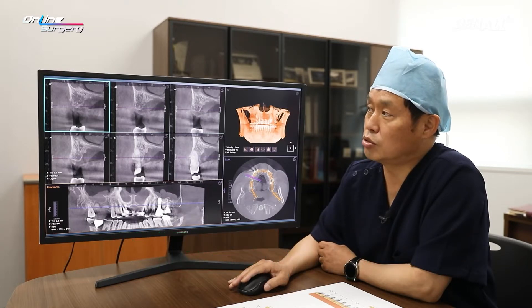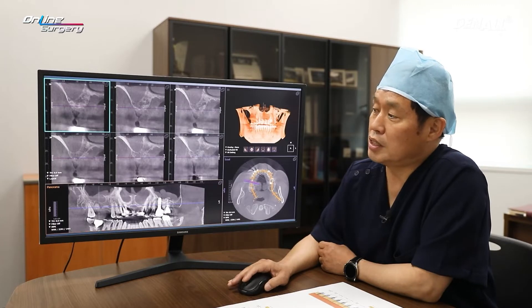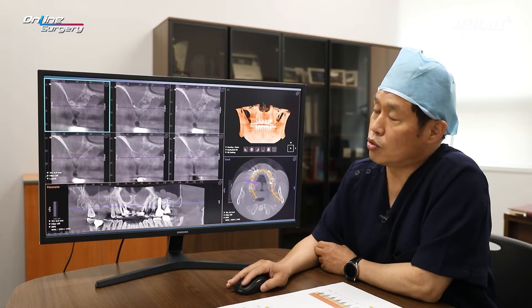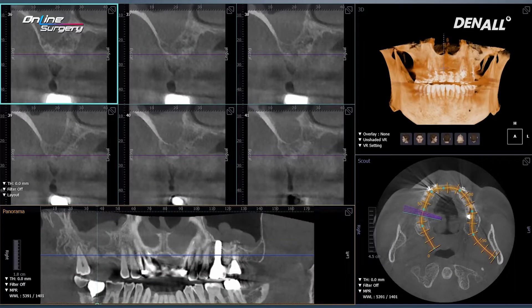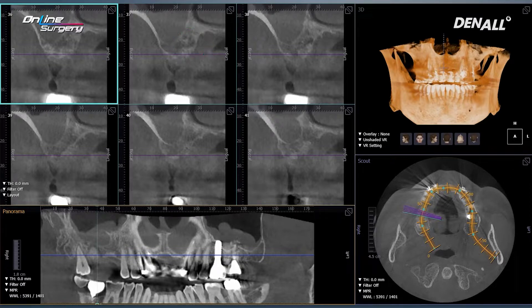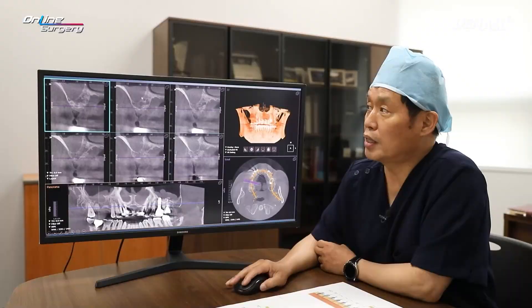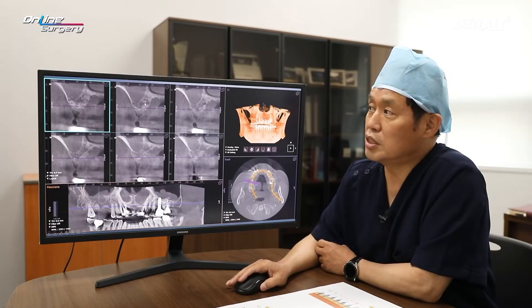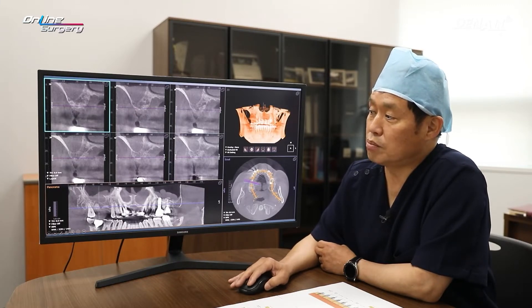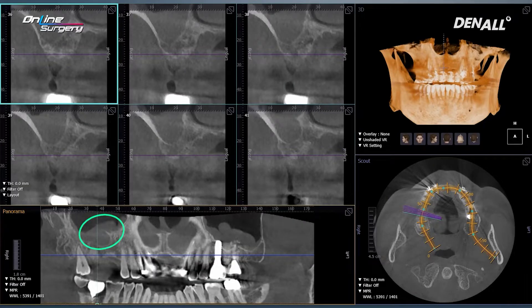In number 16, there is sufficient residual alveolar bone of about 10 mm. In number 17 on CT, the residual alveolar bone doesn't look sufficient on the panoramic image. However, if you look at the palatal side, there is quite a lot of residual bone. The buccal side is resorbed, but on the palatal side there is sufficient bone. Therefore, if you place it there, you don't need to touch the sinus. On the sinus, there is mucosal thickening and a mucosal retention cyst may exist.